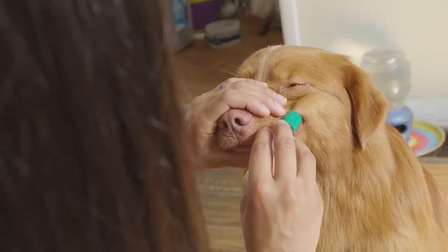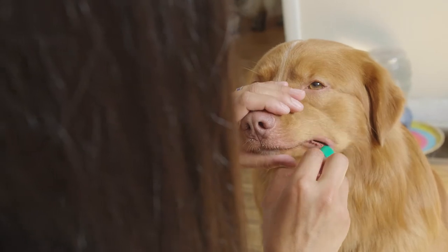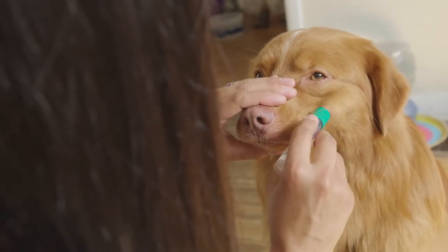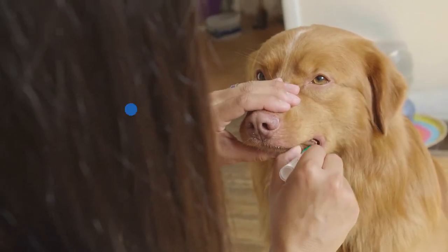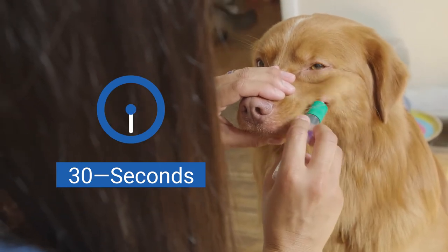Gently press on the inside of your dog's cheek and rotate the swab back and forth for a slow count of 30 seconds to collect a good sample of cheek and saliva cells. Make sure to swab for the full 30 seconds to ensure a quality sample.